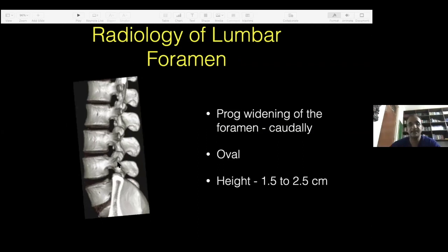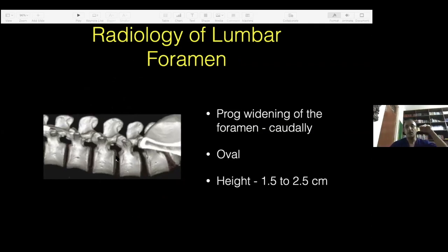So in this fashion, when you're going inside, for this presentation specifically, I would be dedicating the whole of the anatomy to the left side. If you're going from the left side, I don't want you to get confused between left and right. So for this presentation, anything on the left is cranial and anything on the right is caudal, throughout the presentation.